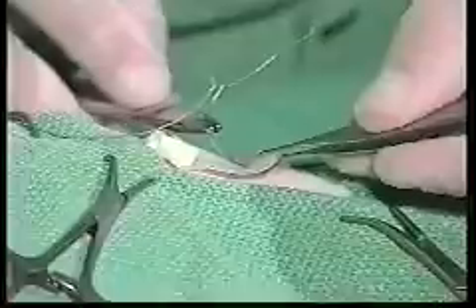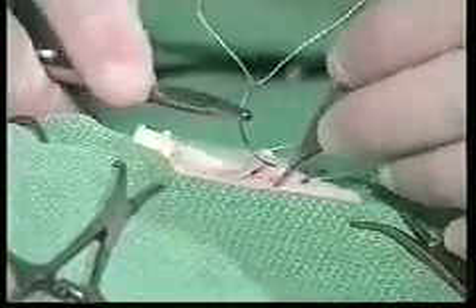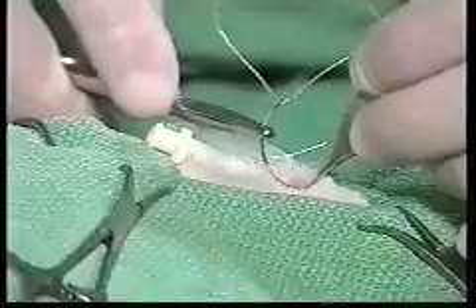The second suture is placed in the 7 o'clock position. Again, we take about a quarter of an inch of the skirt. Now the skin is very tough under here, so you want to use a sharp, strong needle. We are going to take a quarter to an eighth inch of skin directly under where that suture lays.